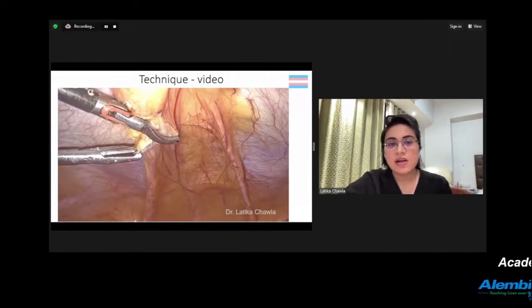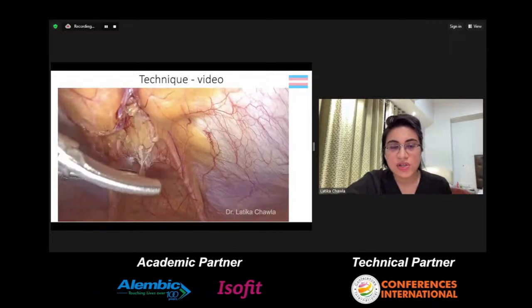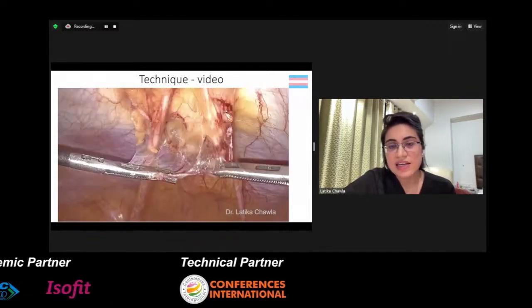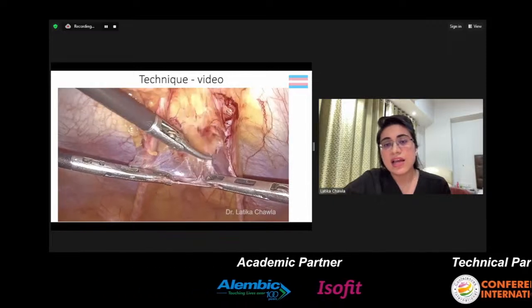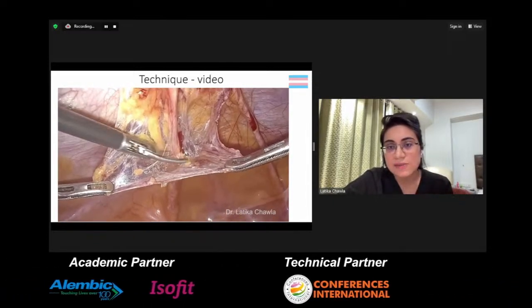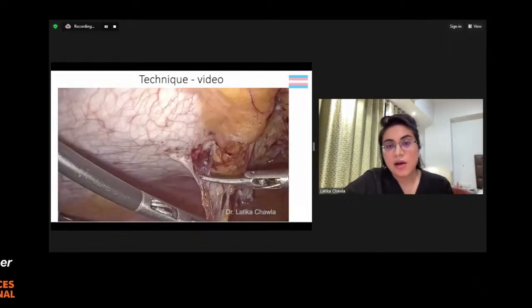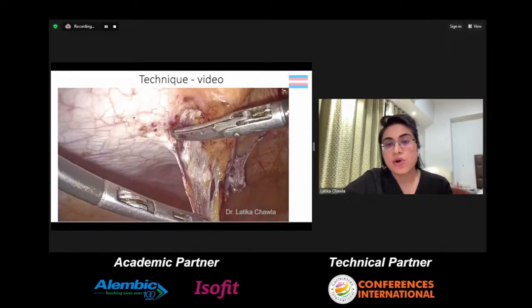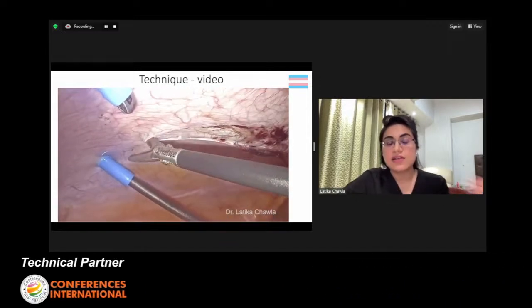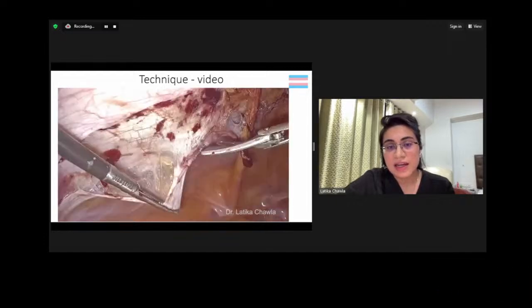I have taken two left lateral and one right lateral 5 mm port for dissection. In areas where the peritoneum is extremely thin, I am not utilizing any electrosurgery because we do not want to compromise on the vascularity as much as possible. As you see here, the peritoneum is extremely thin, and especially when we are cutting it off from the fascia, we have to be very careful about not taking the rectus sheath, the fascia, along with the peritoneal lining.